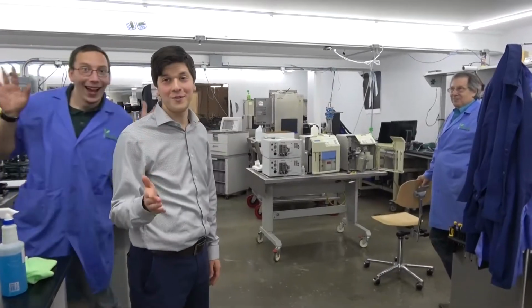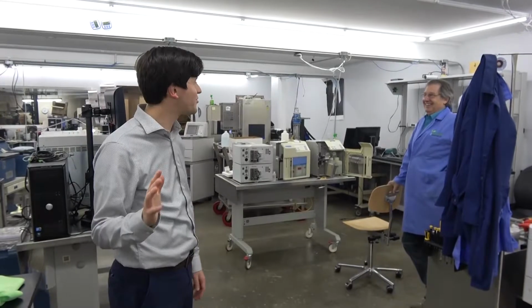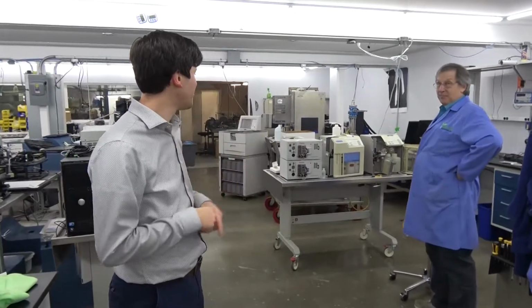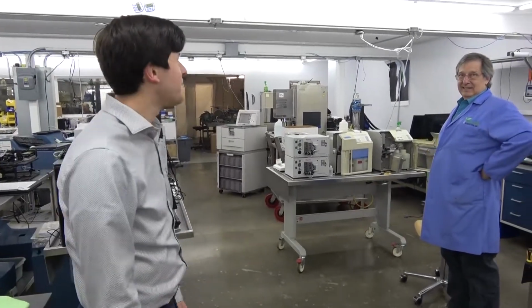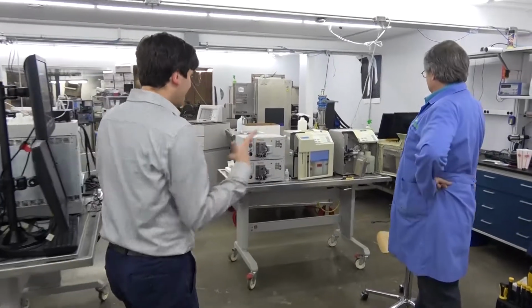Well, it's been a while since we've done a New Life Scientific Tech Shop walkthrough, and I know all of you have just been dying for the next one to come out. So here it is. And we're starting with Steve Free today, who's got a few YSI 2700 Selects that he's disassembled and maniacally reassembled and shocked with electricity, and it lives!